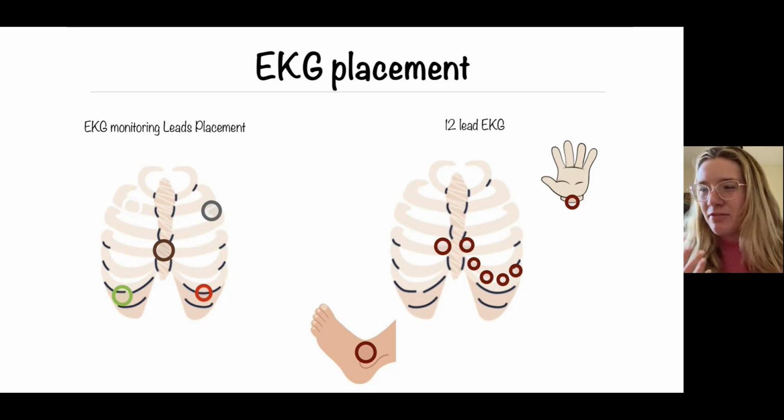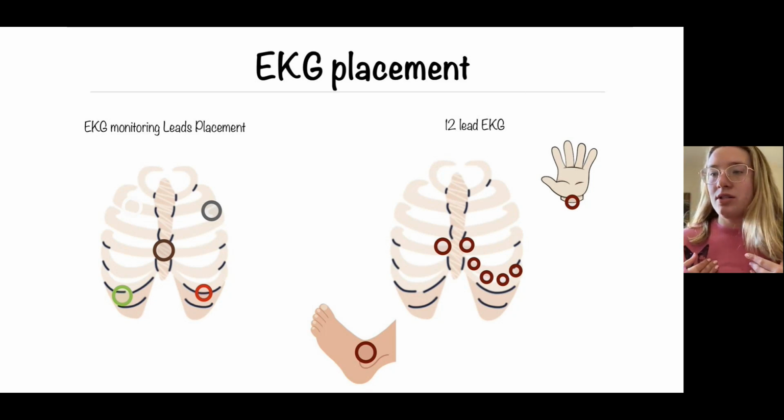So it varies by facility, but usually you'll have about 5 on the chest. You have wherever you would auscultate, like the aortic valve, all of that. So you go across the chest, you go under the breast.